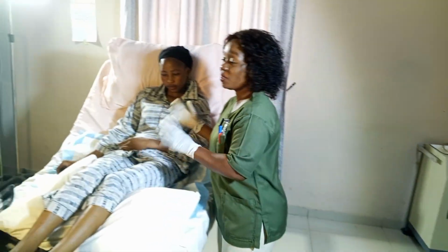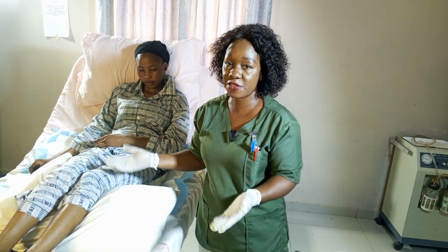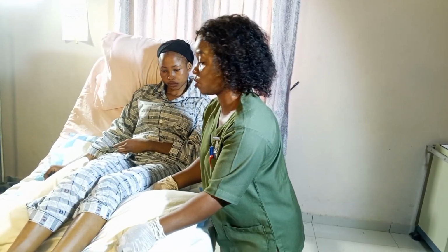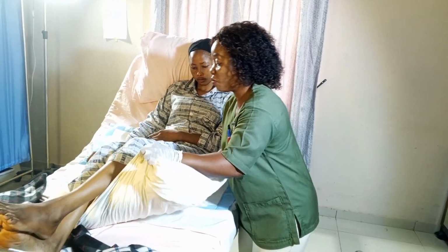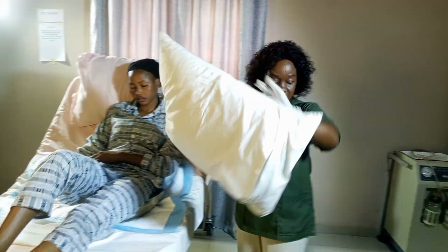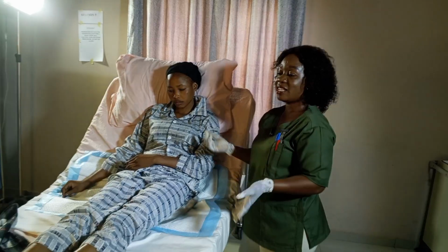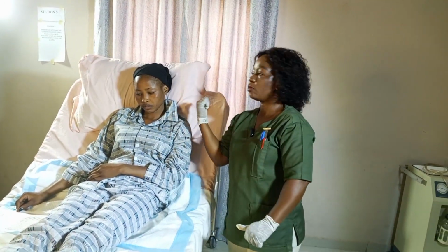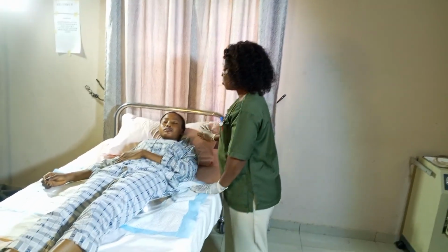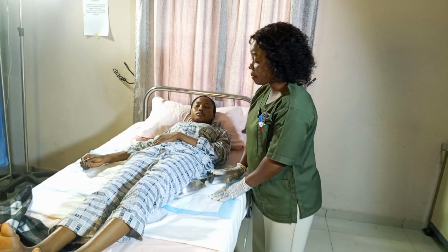Is that okay? Now my patient has called my attention that she is done passing feces, right? So the next thing is for me now to remove this pillow that I use to support my patient, right? I will remove it from the patient's leg by lifting the patient and removing the pillow from the patient's leg. And again, I will bring down the head end of the bed, making it flat, right? Bring down the head end of the bed, and I'm ready to remove the bedpan, right?